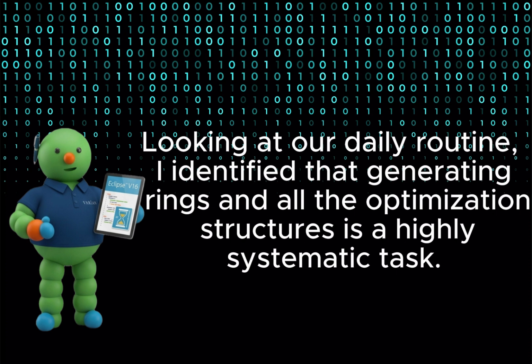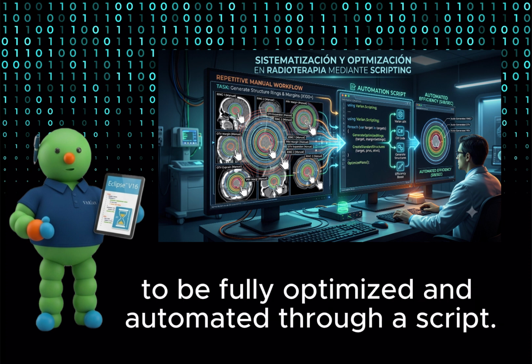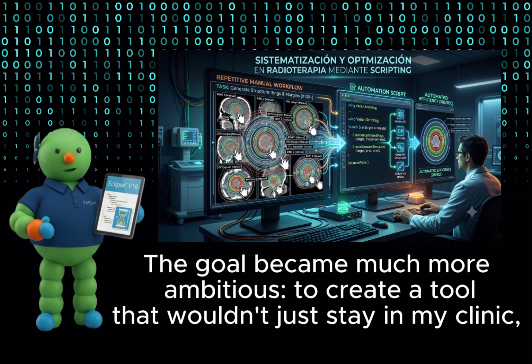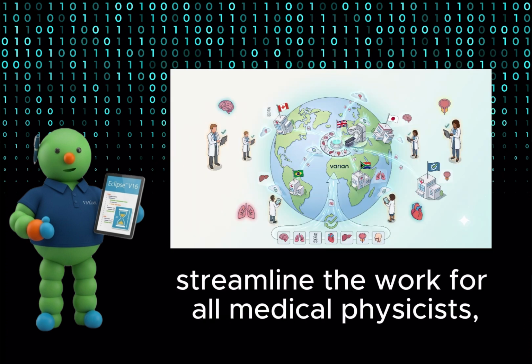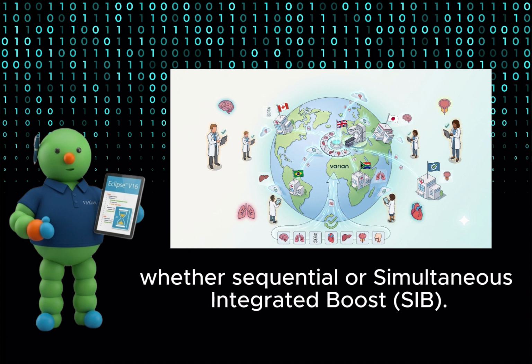Looking at our daily routine, I identified that generating rings and all the optimization structures is a highly systematic task. Because of its repetitive nature, it is the ideal process to be fully optimized and automated through a script. But I realized its potential was much greater. The goal became much more ambitious: to create a tool that wouldn't just stay in my clinic, but that would serve all hospitals, streamline the work for all medical physicists, and above all, successfully adapt to all pathologies and treatment schemes, whether sequential or simultaneous integrated boost (SIB).